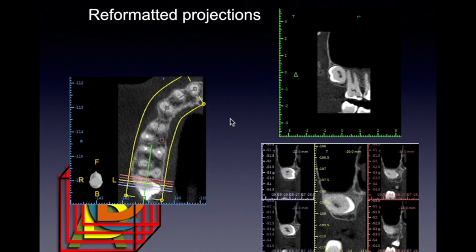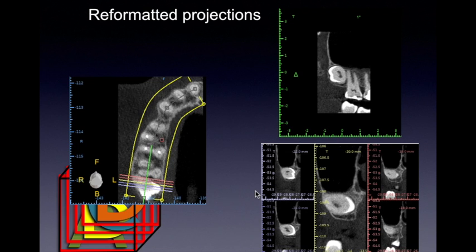I could even tell my computer — because it has stored the three-dimensional image — to get a specific slice of this patient. This green block or window is represented by this line. That means this window is exactly where this line is, and that's where I could see a portion of my impacted tooth, with its crown appearing to point towards the distal side. I see the second molar with two roots because this green line runs across the buccal roots. That is the additional projections that may aid us in diagnosing.